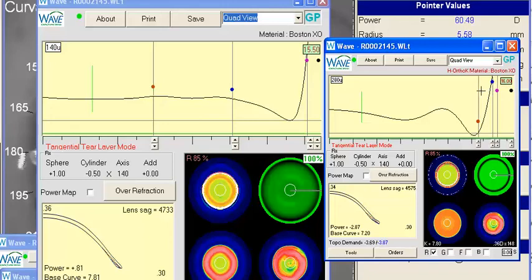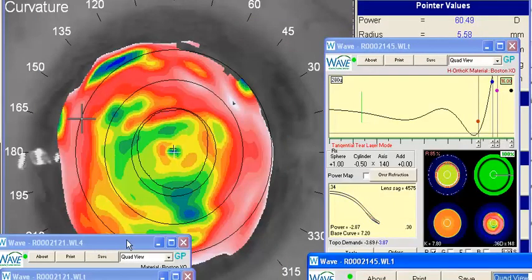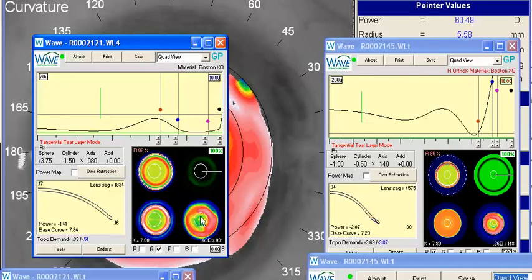And just a side note, I went back and looked at your original on-corneal designs, and one thought is if you end up having to go back that route, if you try to reinvestigate that, sometimes what I'll do on these lenses, because you end up with a pretty small landing area, so it doesn't give you much area to work with, is try to get a little bit larger landing area to incorporate this mid-curve to see if I can line it up a little more along that steep meridian on this lens.